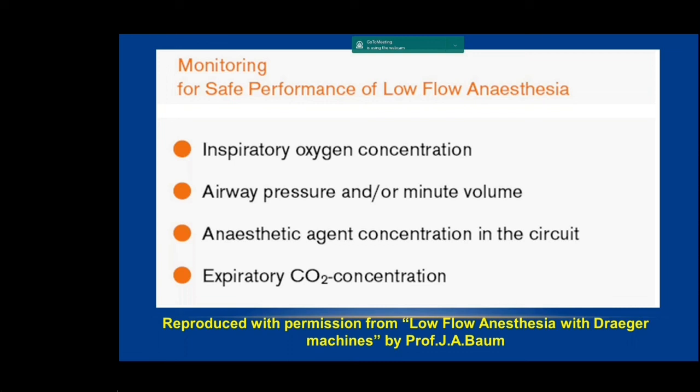You should always have a respiratory gas monitor, and certain parameters always included, like inspiratory oxygen concentration, expiratory oxygen concentration, and if you're using nitrous, inspiratory nitrous or expiratory nitrous, airway pressures, the flow volumes, the loops, the anesthetic concentration going in and coming out, expiratory CO2, inspiratory CO2, compliance, whatever the pressures; all the parameters are absolutely mandatory.